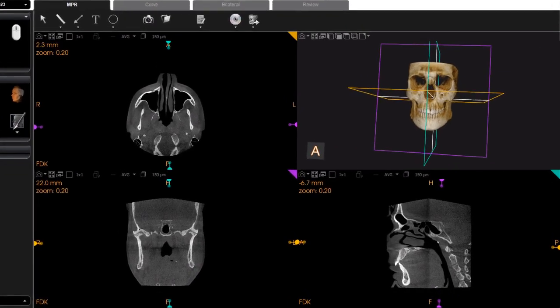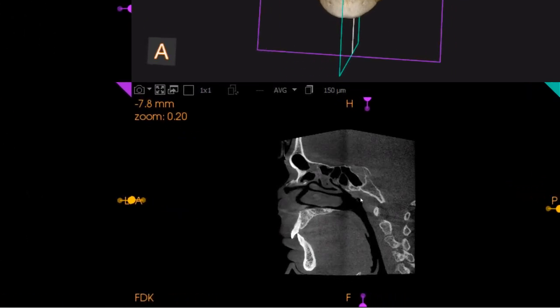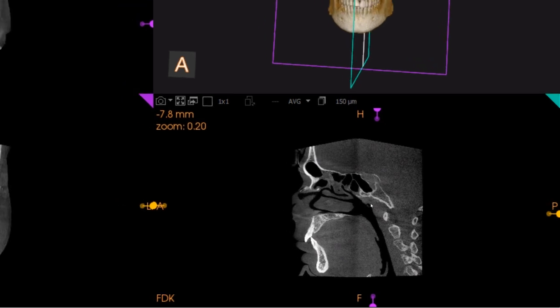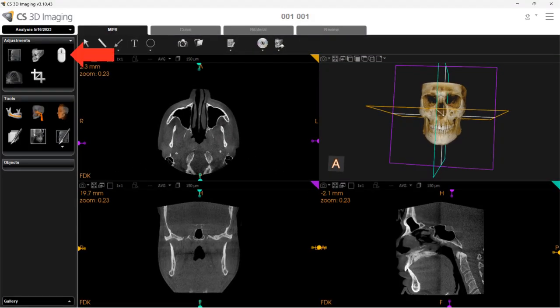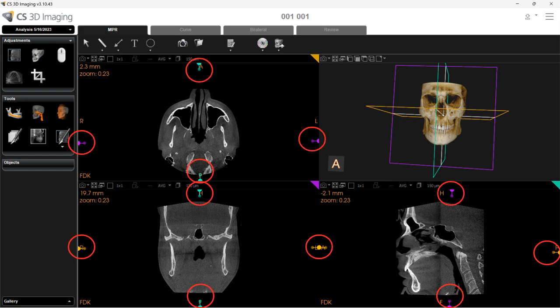To move through the slices, place your mouse over the view and use the wheel on your mouse to scroll through the slices. The mouse function settings can be set to your preference. You can also use the round colored handles to move through the slices. If the view has two round handles, the larger round handle is used to move through the slices as with scrolling, and the smaller round handle allows you to tilt the angle of a slice plane.